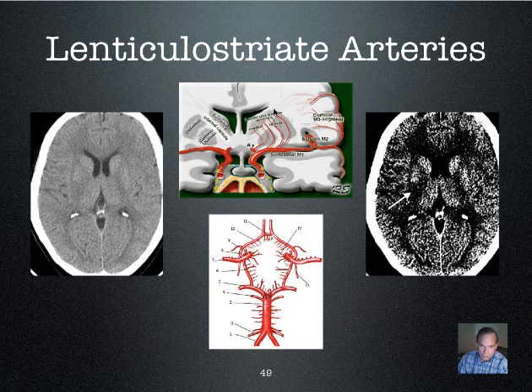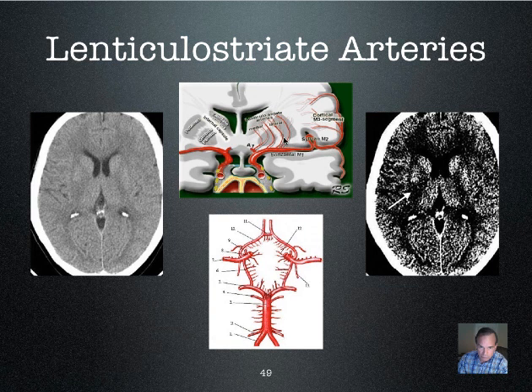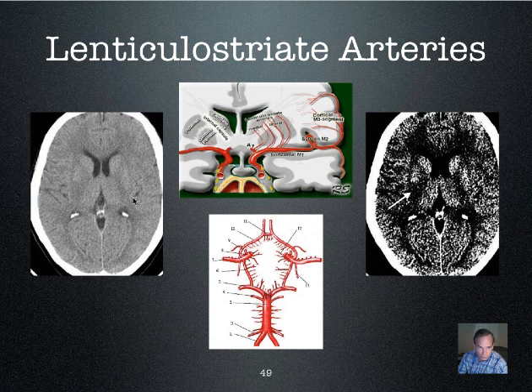Small branches come off the m1 segment of the middle cerebral artery that perfuse areas of the basal ganglia. Here on CT you can see a little lentiform structure, and there is a defect in it — an infarct of one of these small branches coming off the m1 segment of the middle cerebral artery.